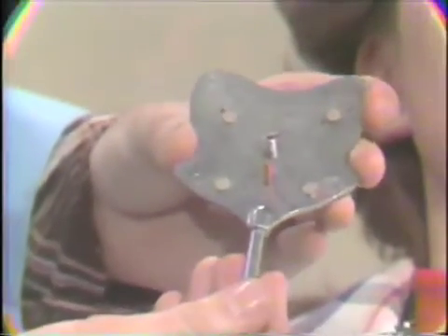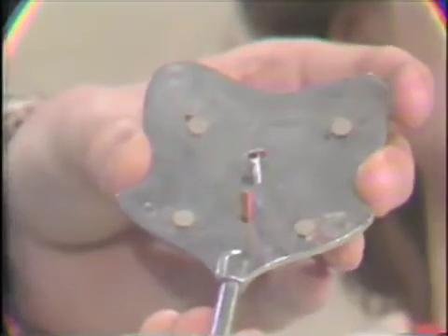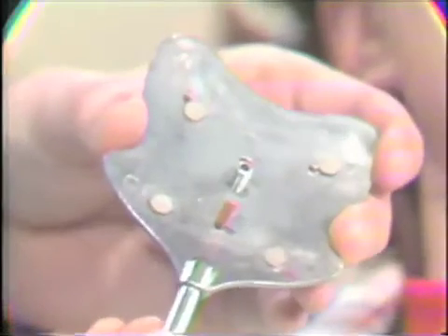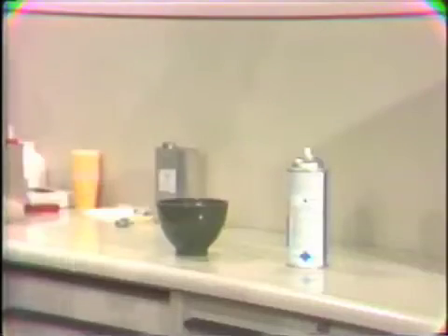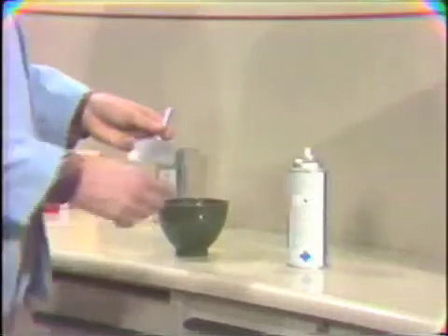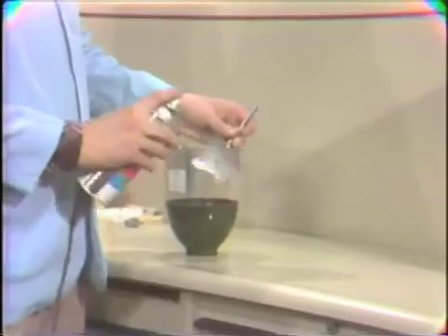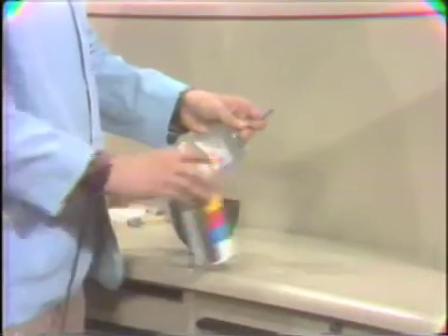This will hit the anterior teeth. This is just used as a guide when we put the former into the mouth. Now we're ready to load the acrylic onto the clutch former. Okay, now the first thing we'll want to do to our clutch former is to spray it with a little lubricant so the acrylic is easy to remove from it.